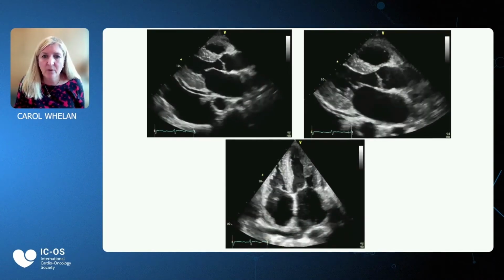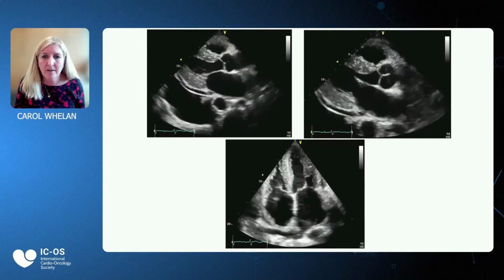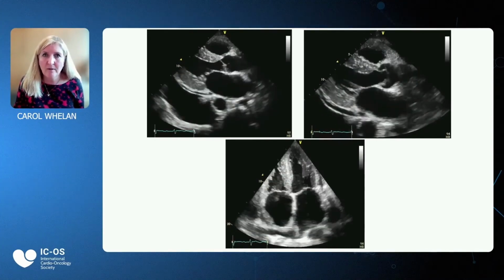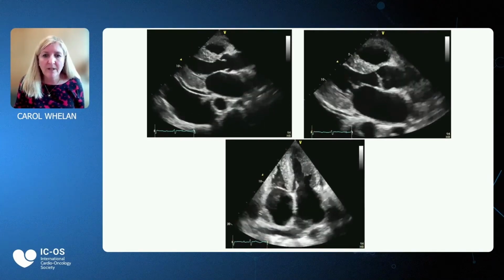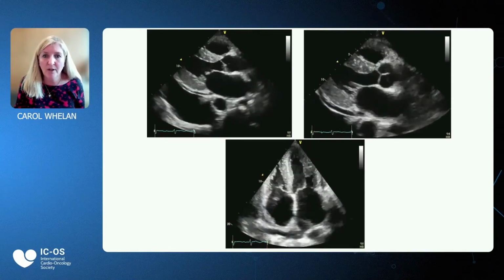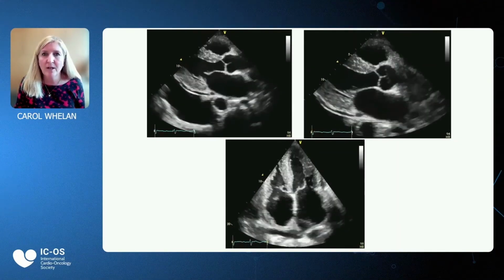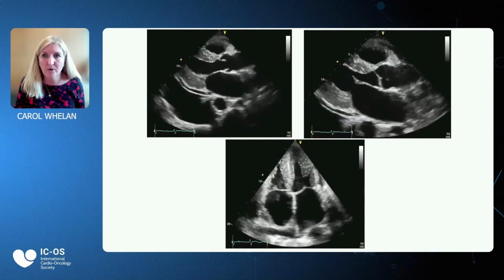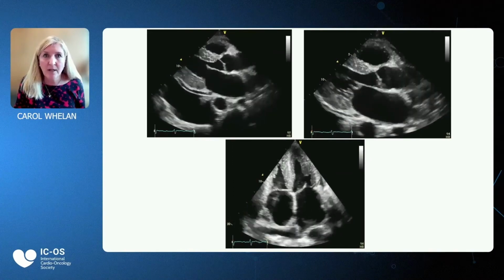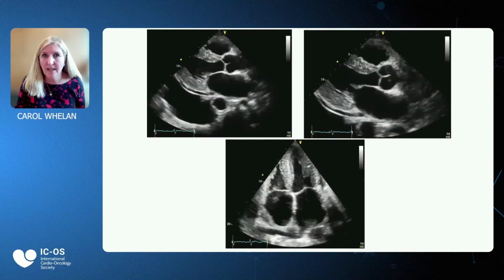In this moving video, we can sometimes be lulled into a false sense of security about the overall heart function because the apex typically is spared and functions to a degree normally. But it is the longitudinal function that causes the problem. And we can see here there's very little longitudinal function in this heart. This is typical of amyloidosis, and we can use this information to get the longitudinal strain, which is impaired in cardiac amyloidosis. This can be measured after the routine study. It is very straightforward to do. The measurements can then be taken offline.